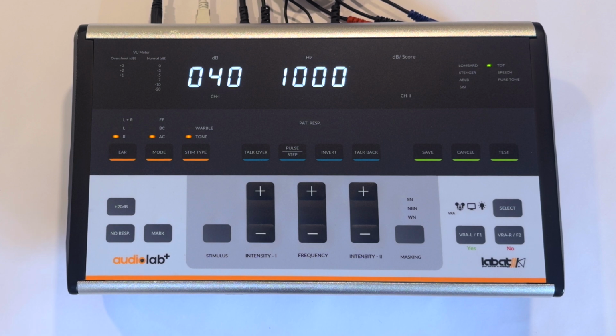Instruct the patient to press and hold the response switch for as long as the tone is audible. Set the intensity level according to the patient's threshold and start the test by pressing the stimulus key. Monitor the patient's response using the built-in timer on the device.